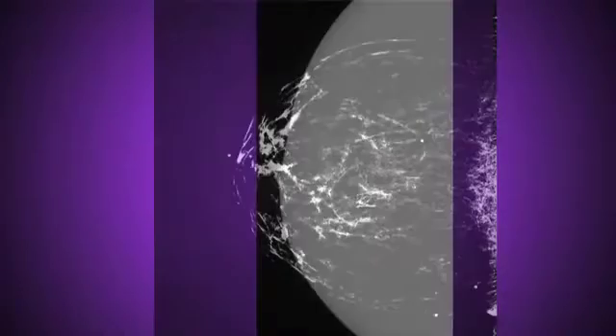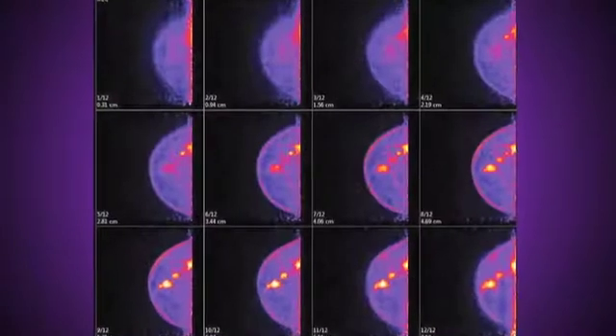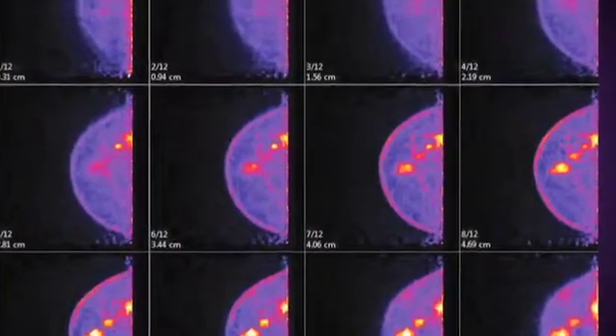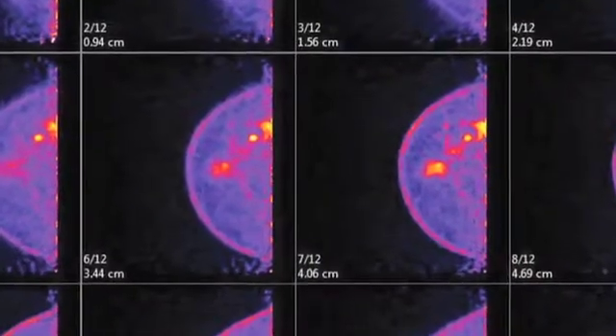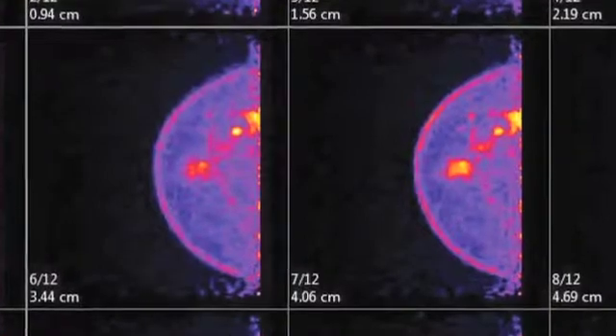The PEM scanner works as an adjunct to other conventional imaging procedures. Conventional breast imaging looks at the breast for anatomic changes, whereas PEM looks at the breast for metabolic activity, helping clinicians to detect, stage, and manage breast cancer earlier and more accurately than ever before.